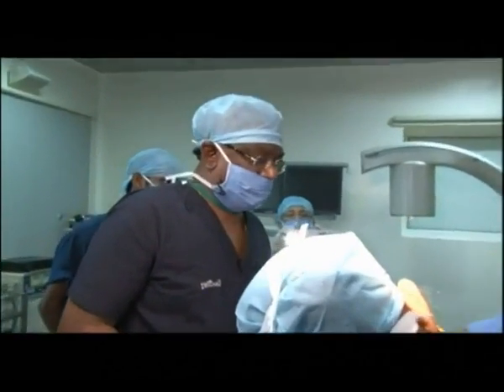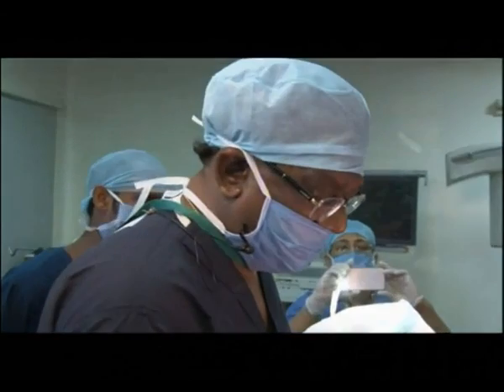Hello. Yes? I'm continuing from the previous case about fixing of the catheter. You use that locking device which is available for fixing the catheter? Sir, on my regular basis, I use only a Vygon epidural needle and catheter which is 9 centimeters with a polyurethane catheter. So that does not have any fixing device. I do not use any other epidural needle in regular anesthesia practice. So I am not able to understand what you are telling of the locking device. I am not exposed to that.